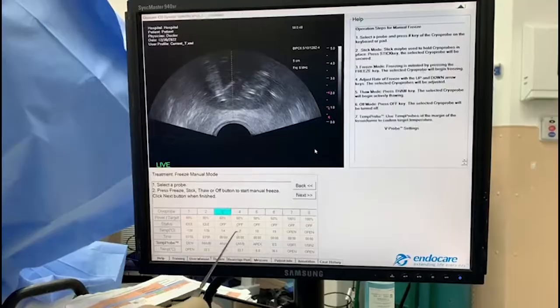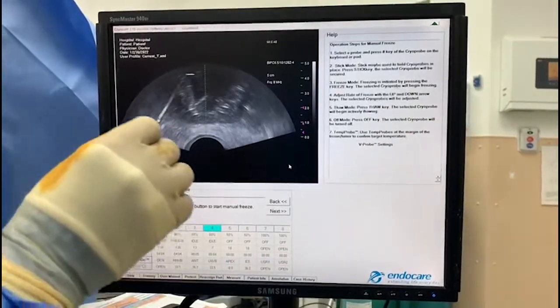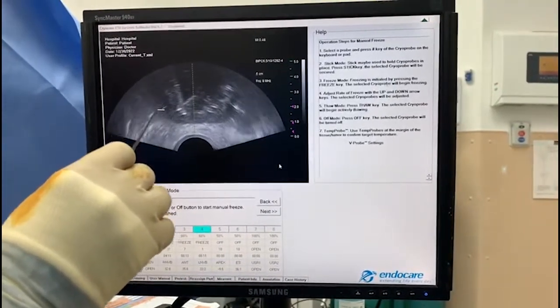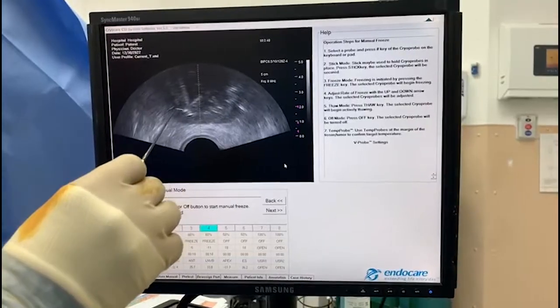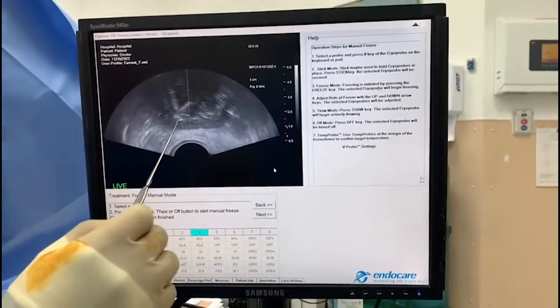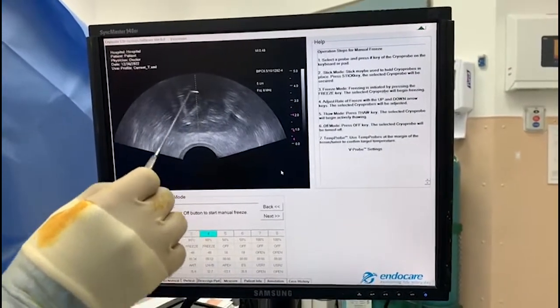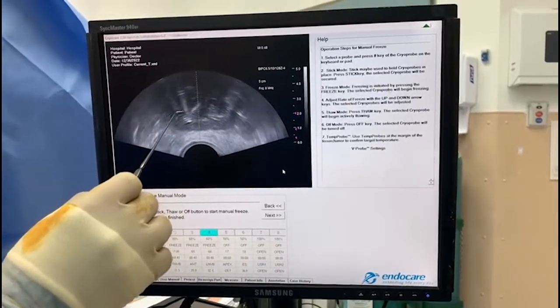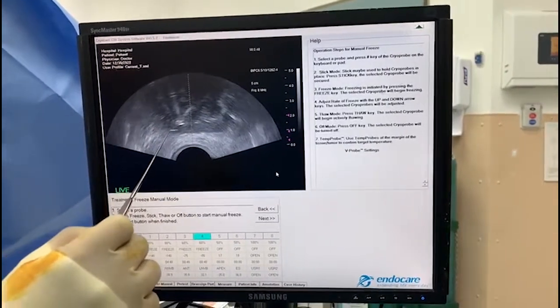We're going to turn on probes three and four at this point, then expand down to five and six, which are my posterior probes. We want a full freeze — the ice balls will congeal together and you'll see it go faster as we combine them. One thing I love about this system is that I can individually control each channel. If I'm going faster on the right than the left, I can slow the left down or stop it altogether, or increase the speed on one side to catch up. It's variable in terms of length and each individual channel, which makes this very advantageous.